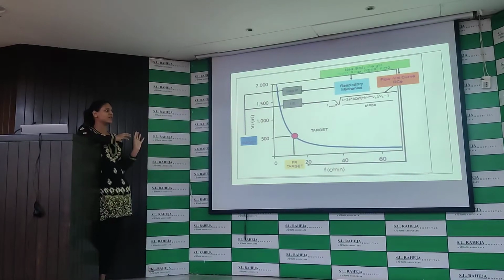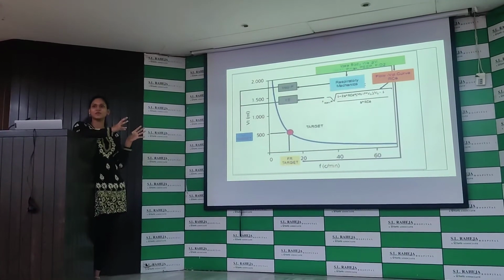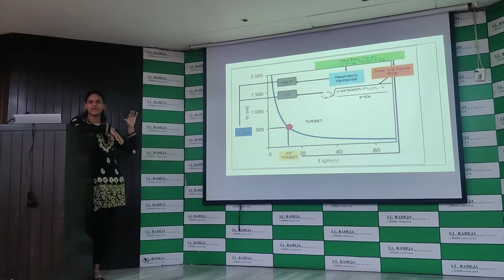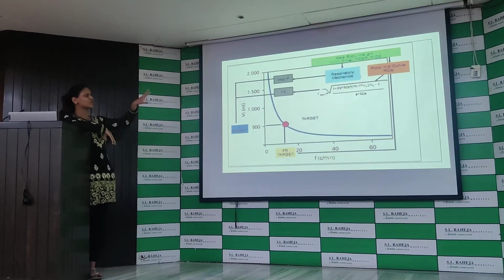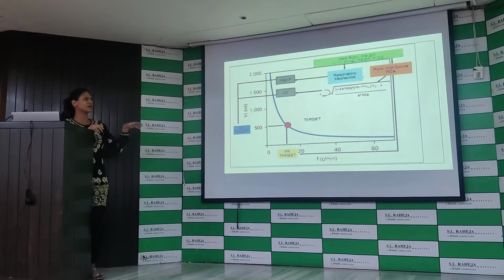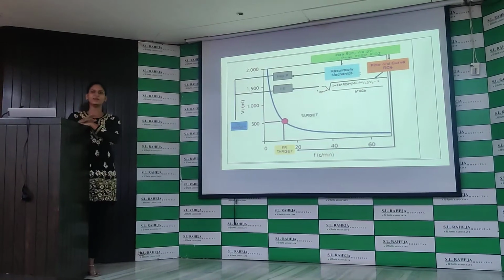From there, it tries to come to a safer tidal volume and respiratory rate, so that the minute ventilation is achieved. It also adjusts the IE ratio and the inspiratory pressure. So it calculates everything through these equations and comes to an optimal rate.